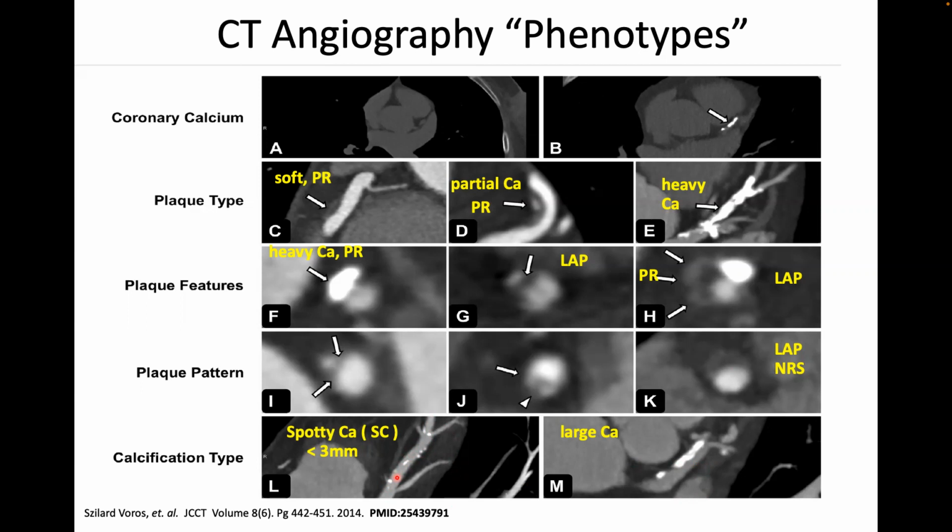And some of the early adopters of coronary CTA ran research programs that built up databases of thousands and thousands of patients, and now the outcomes of those patients are known. They've started companies that are using deep learning, artificial intelligence, machine learning, et cetera, to try and characterize these lesions and the risk. So come up with a risk score that basically looks at these features.